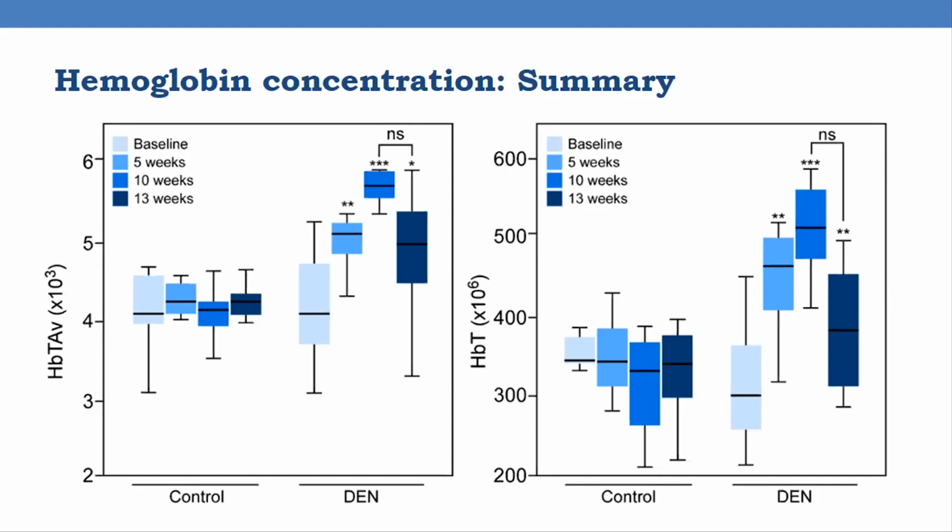But after 10 to 12 weeks, it starts to grow the tumor also. So the time point between 10 to 13 weeks is the onset of tumor formation in the liver. When there is a tumor formation in the liver, the tumors demand more and more oxygen and nutrients, which cannot be supplied by the angiogenesis, and that's why we are seeing a little decline in photoacoustic signal.